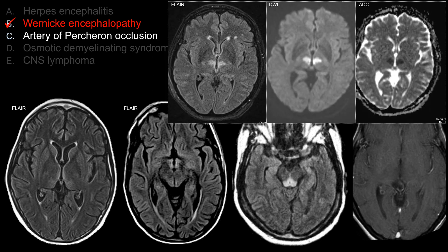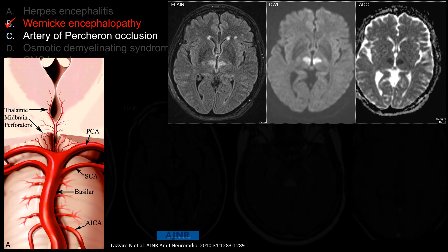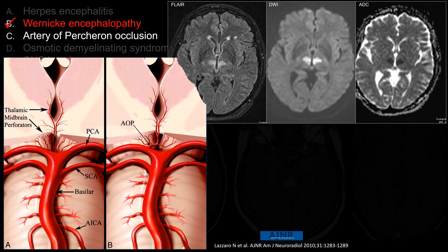This is an example of bilateral thalamic acute infarction due to artery of Percheron occlusion. Notice that there's abnormal FLAIR signal and restricted diffusion involving the medial thalami bilaterally without affecting other structures in the PCA territory. Normally, the medial thalami are supplied by small perforating arteries originating from the tip of the basilar artery or from the proximal P1 segment. Artery of Percheron is an anatomical variant where a single trunk artery from a common origin supplies all the same structures including the medial thalami. In order to cause bilateral thalamic infarction in normal anatomy, you need a thrombosis large enough to obstruct both arteries — a typical basilar tip thrombosis, for example.